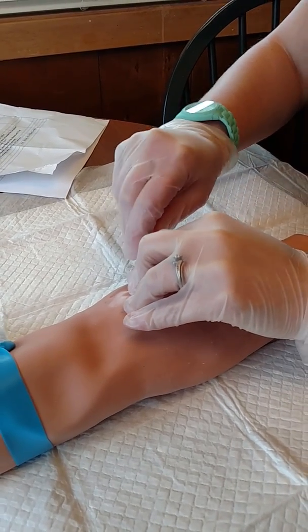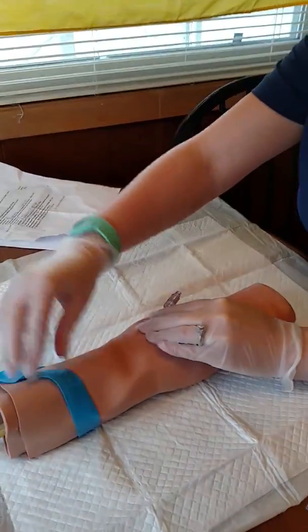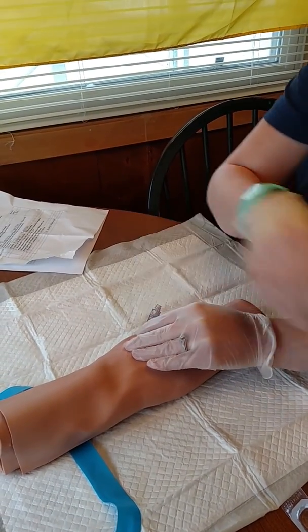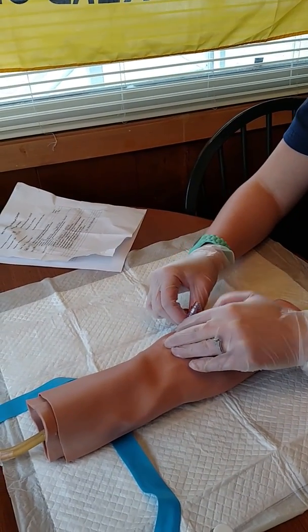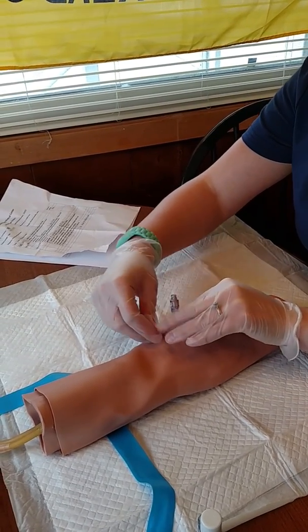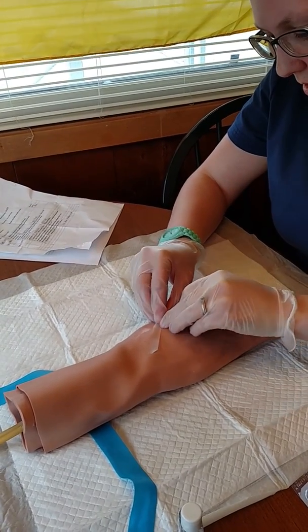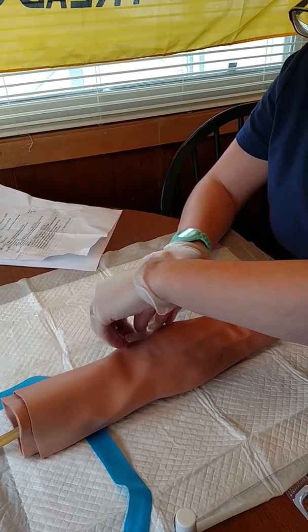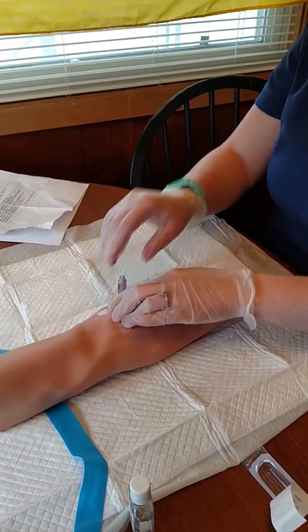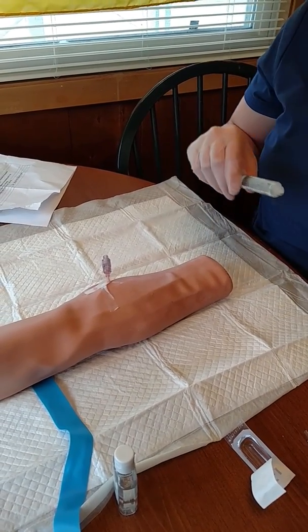And I had my flash of blood, so we're good there. Now I'm going to go ahead and release. Let the pressure off. Chevron it here real quick. Stick there. Alright, how is that, Ivy? It's good. Okay, I'm just going to flush out here.